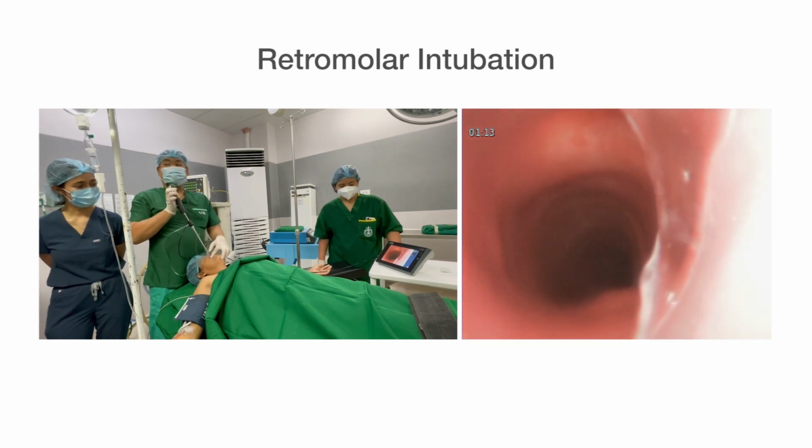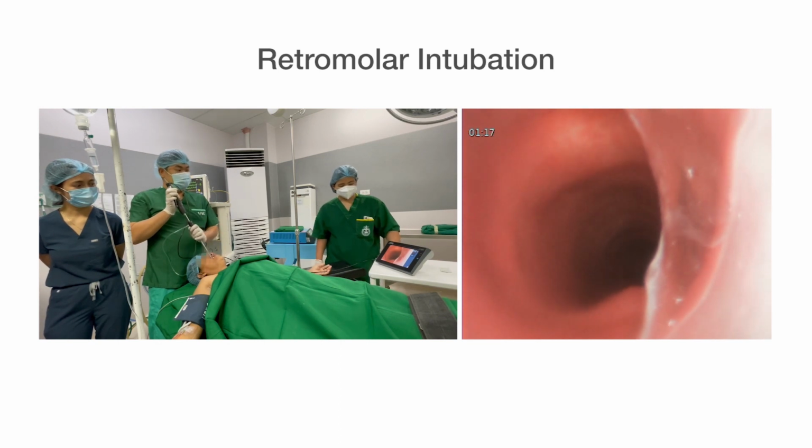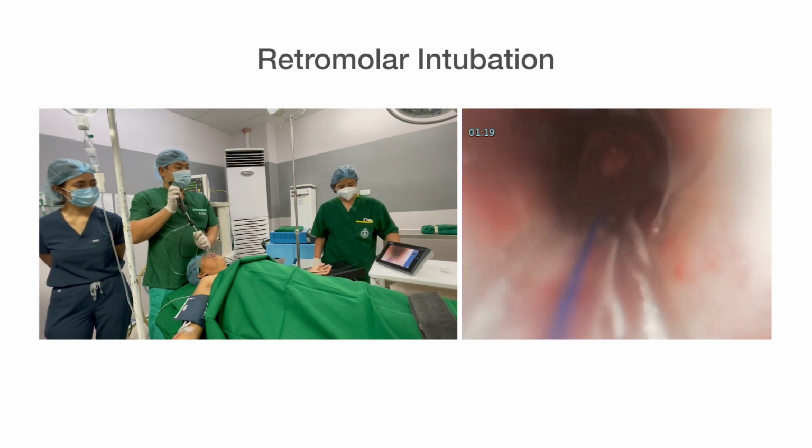I enter the vocal cords, and once I no longer see the vocal cords, I push down the ET tube.